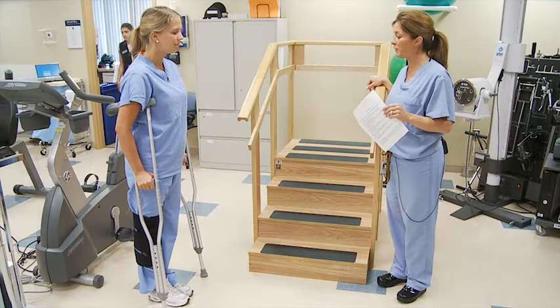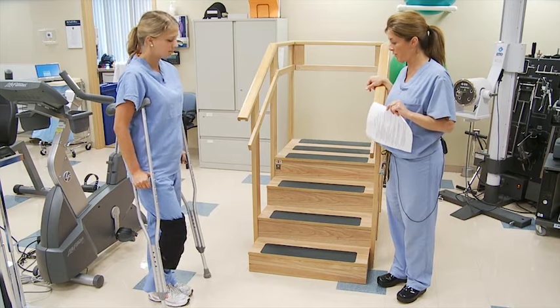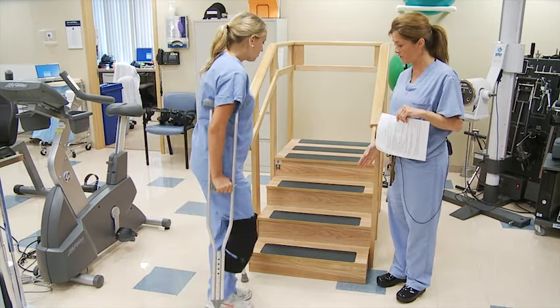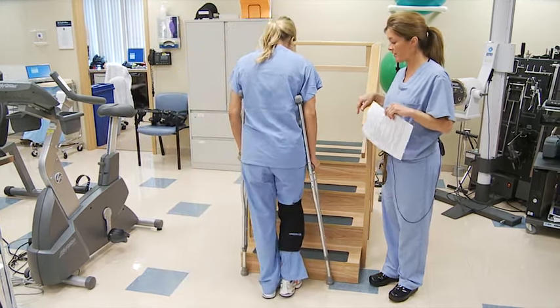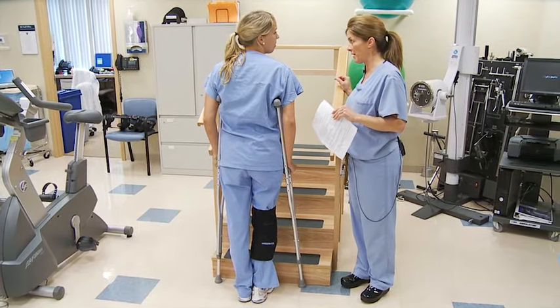Sarah, hi. I'm now going to teach you how to use crutches going up and down stairs. I'm going to have you crutch walk to the stairs, bringing the crutches to the edge of the stair. I'm going to explain the sequence first, and then you can try it.